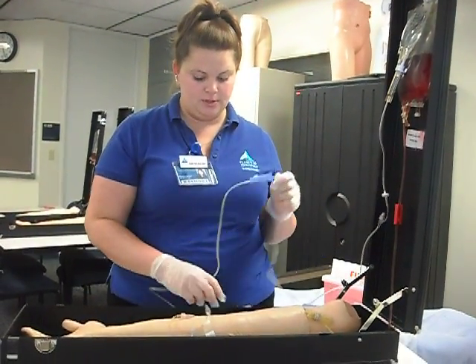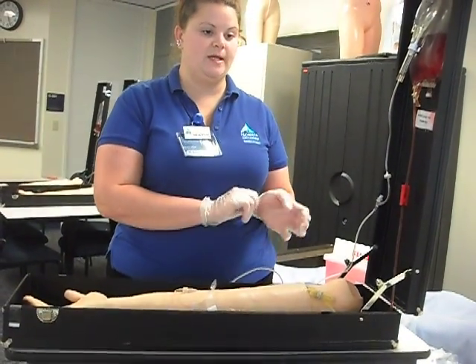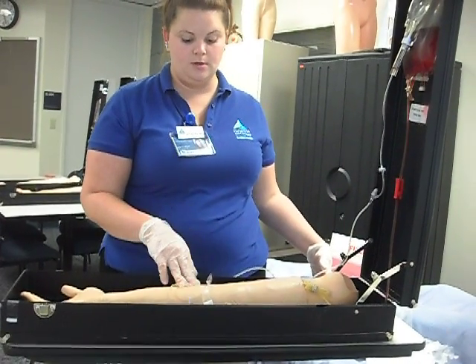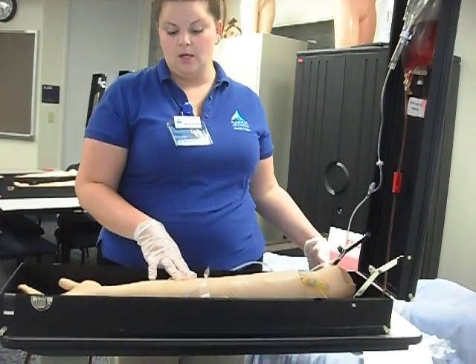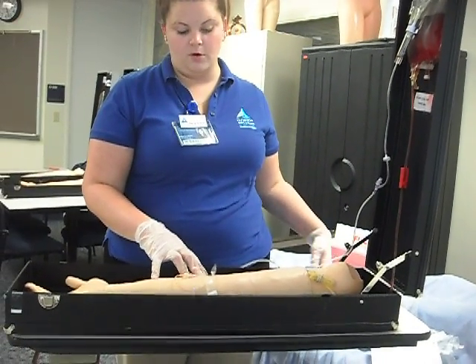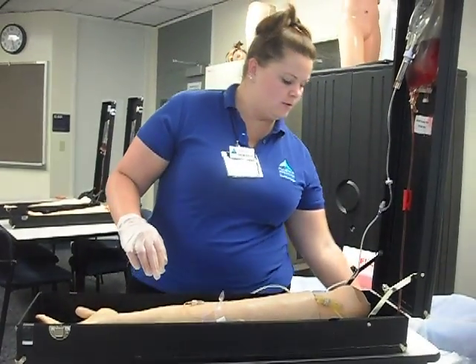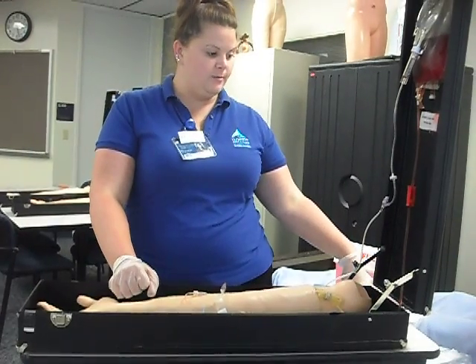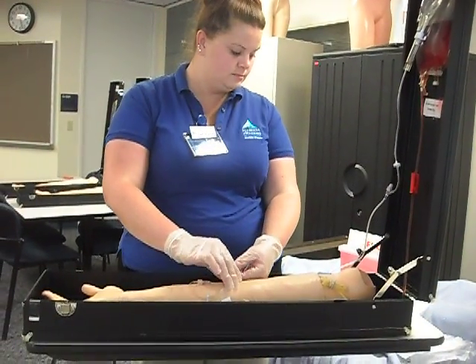And I am going to take off my gloves and wash my hands, and I am going to check on the patient periodically to make sure that it's not infiltrating or anything's wrong with it. And when it's done, I am going to come back in and I am going to disconnect the site.